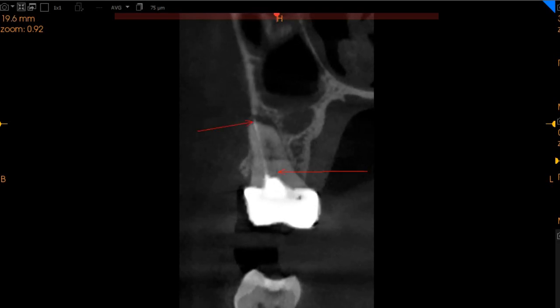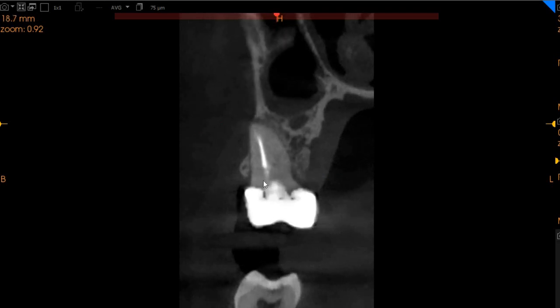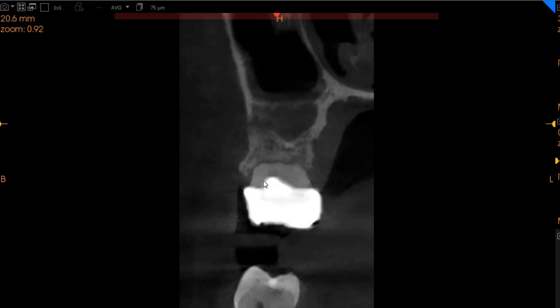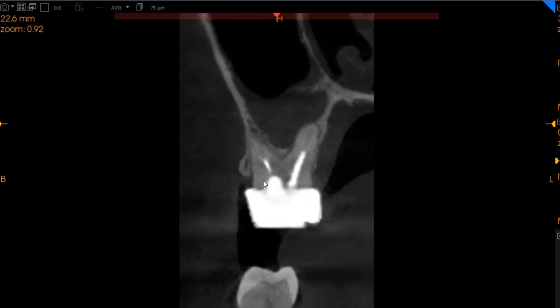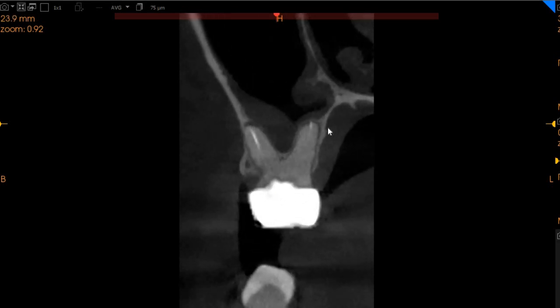We've got over-obturated GP on the upper right MB1 canal. We can see all the obturated GP and a radiolucency moving to the palatal aspect of this tooth. The palatal route also has a little bit of an over-obturation right here.